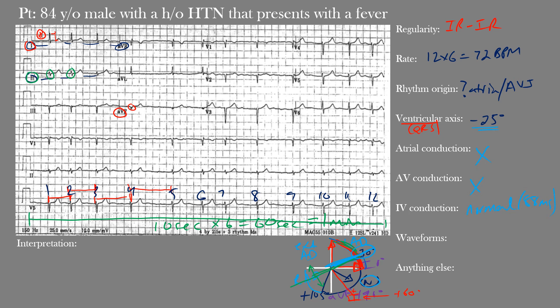For the waveforms, P waves are absent. Now let's discuss the abnormal Q waves visible in the inferior leads III and AVF, and possibly in V1. Pathological Q waves are defined as Q waves at least 30 milliseconds wide and at least one millimeter deep in at least two anatomically contiguous leads. Alternatively, QS complexes in two contiguous leads also qualify. In leads V2 and V3 the criteria differ: Q waves at least 20 milliseconds wide, or QS complexes.